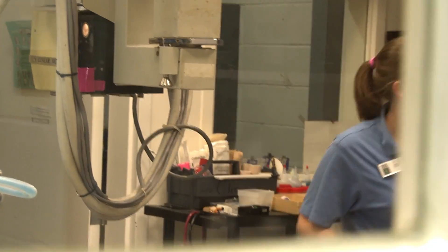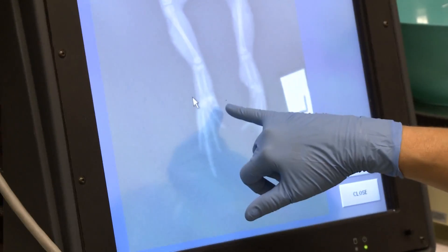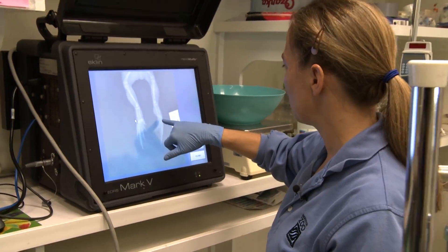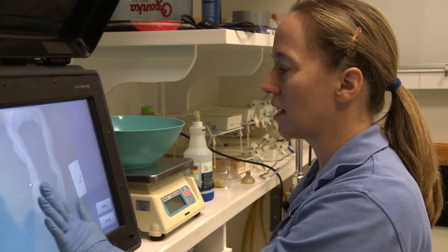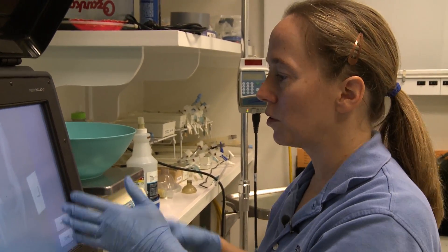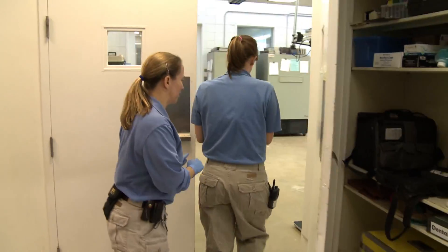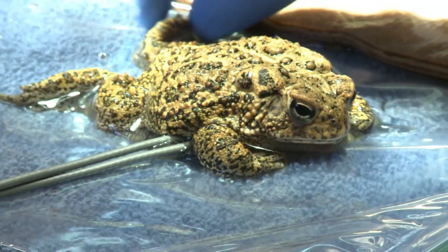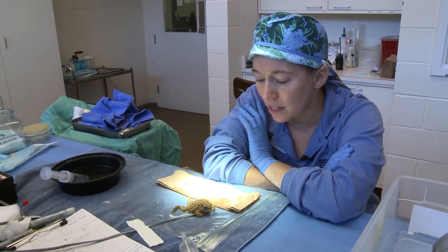This is a good view of a normal foot on his right side. On his left foot, we took off this entire small toe and most of that one — I cut through the metatarsal there. Now in the future if his foot starts to look swollen, we have a baseline to know exactly what it looked like after surgery, so we'll know later if something's different — like if the cancer comes back and starts to eat away at the bones, which it won't because we got all of it.